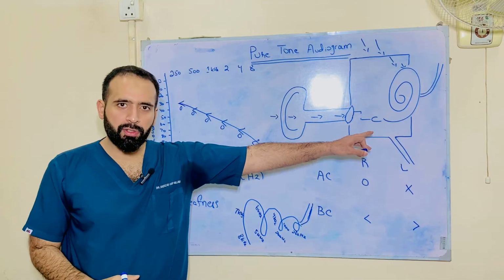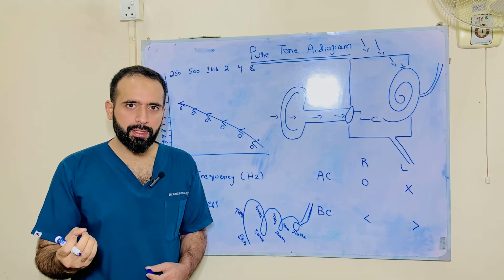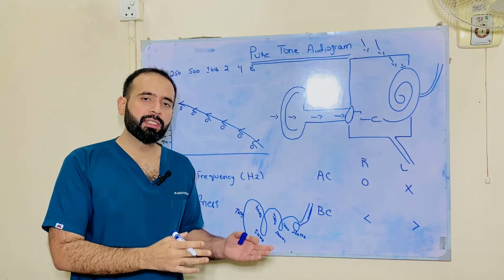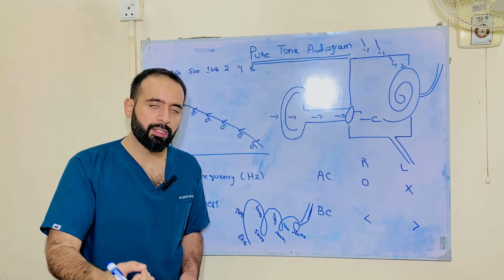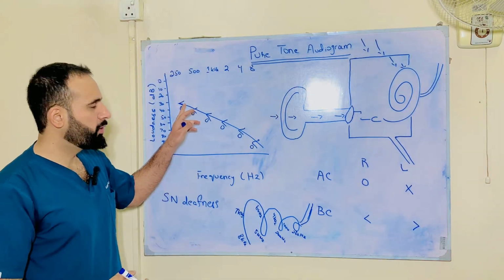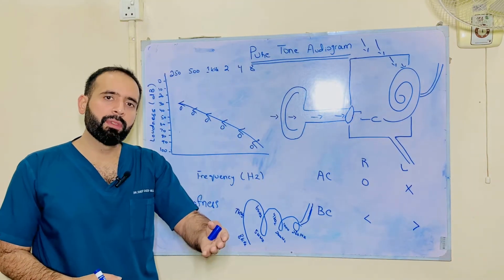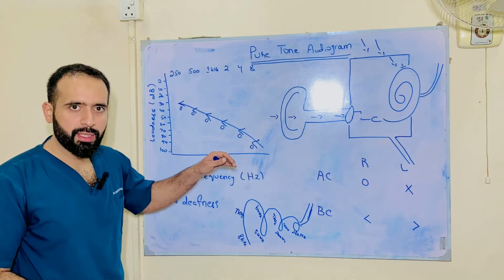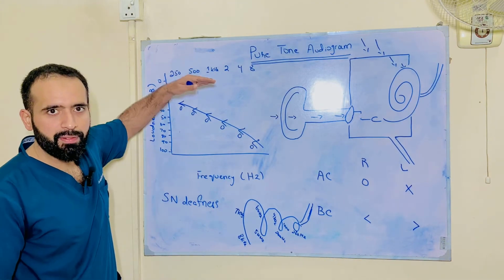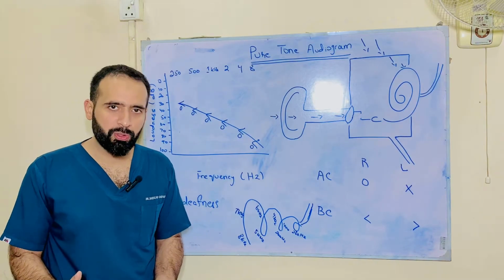If the receptors in the cochlea cannot appreciate the sounds coming in through a better conductor, they will not be able to appreciate the sounds coming in through a medium which is not a better conductor. So if the receptors in the cochlea cannot hear the sounds coming in through the bone, it is impossible for them to appreciate the sounds coming in through air conduction at a higher level than bone conduction, because bone is a better conductor of sound.